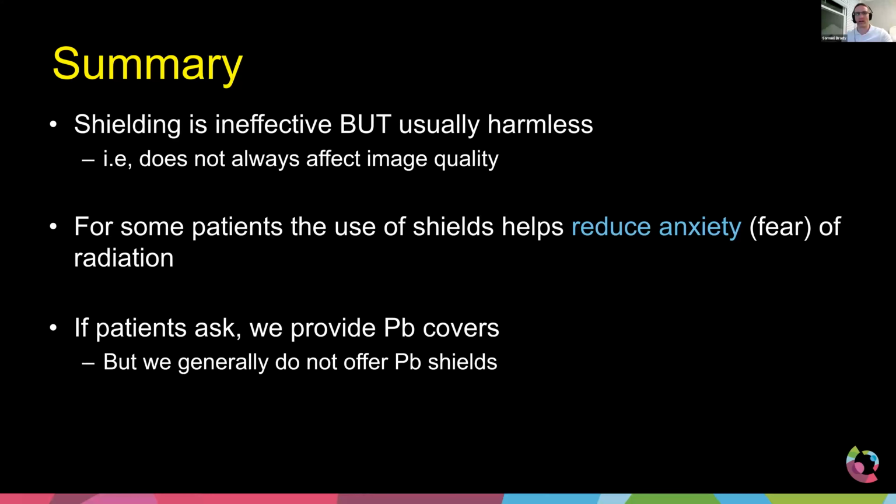And even a large patient can get an abdominal image or CT of the abdomen or pelvis, and they'll get a CTDI vol value of somewhere in the 10, 15 milligray range. When you actually take that value and use it to calculate the dose to the organs, it's much lower. Obviously, remember, CTDI vol is not patient dose. But the point here is, if it's medically necessary, then the amount of radiation we're using is low, and so most likely there's not going to be an issue.